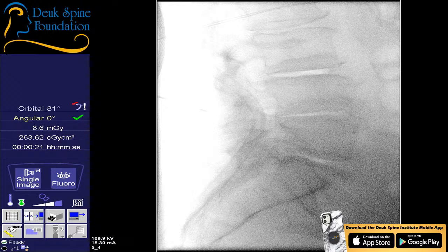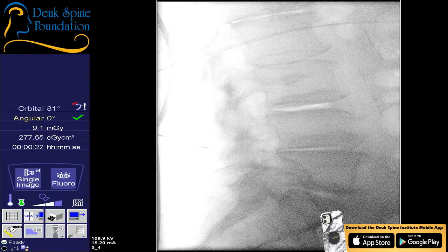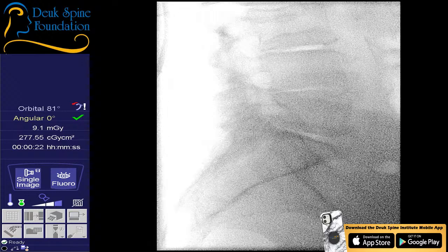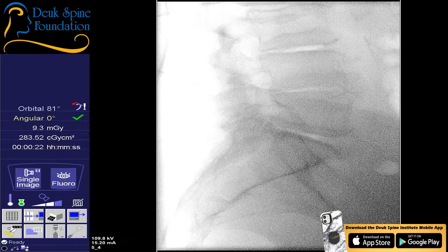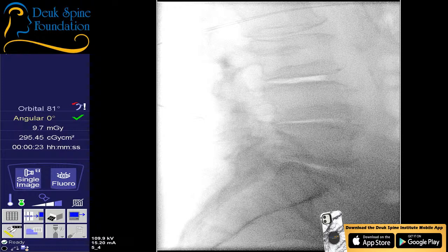Before I do that, let's move this tube. That's good. Shot. Let's just see where we are, because I think the tube was getting in the way. All right. I think the pedicles of L5 are still bad. So let's see if we can't get it better. Shot. Shot. That seems to be worse. Let's see. Shot. Definitely worse. Shot. That may be the best we're going to get right there.